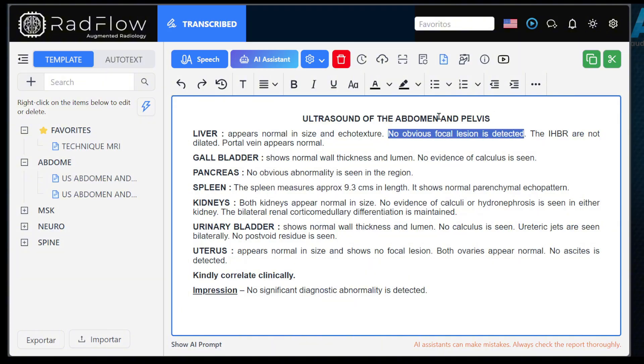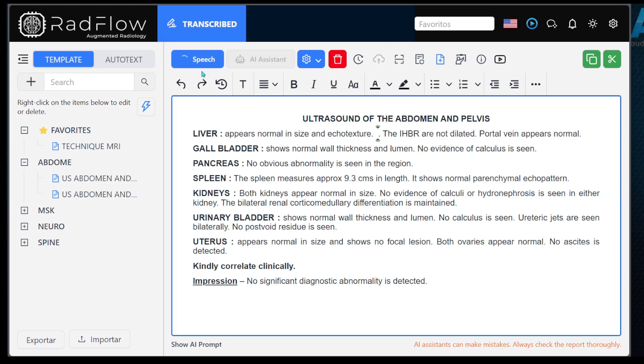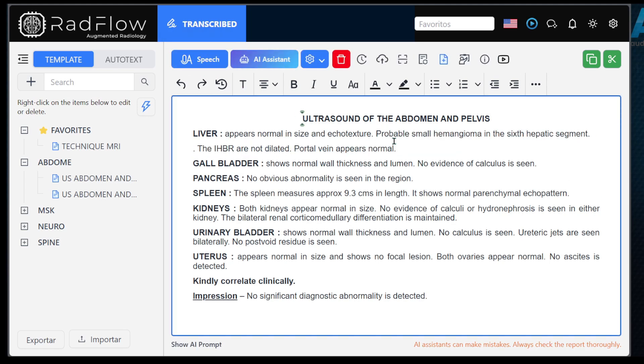It can be used to make final corrections to the report, add new paragraphs, or even transcribe the entire report. It captures everything dictated, and if you make a mistake, you can correct it during the recording itself. Check out this example.